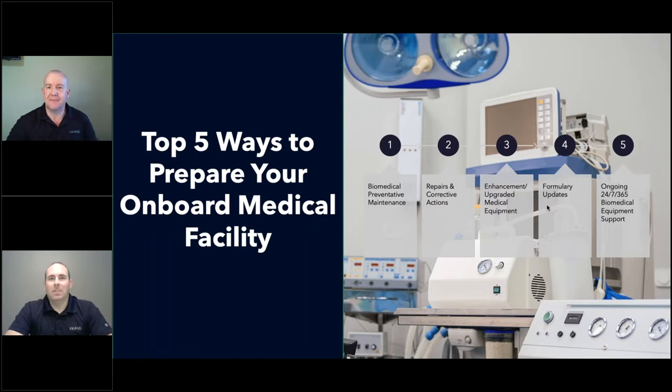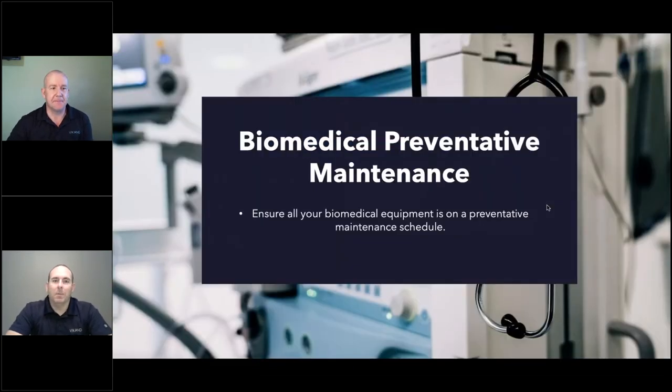Great question, Russ. Essentially, it's all about risk management and patient safety. We look at preventative maintenance as just making sure that a medical device is performing optimally the way the manufacturer designed it to perform. You could think of it as changing the oil in your vehicle. You do that to prolong the life of your vehicle, and we do that with medical equipment. We want to make sure it's cleaned, everything is functioning correctly, it's calibrated. We also start looking for signs of wear and tear so that we can correct those minor issues now so they don't turn into a large risk or a more expensive repair down the road.